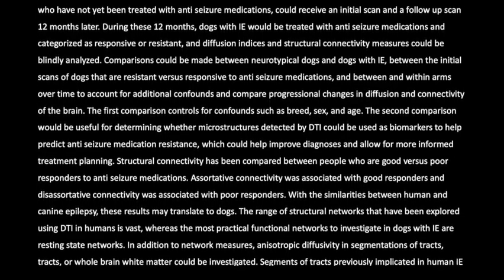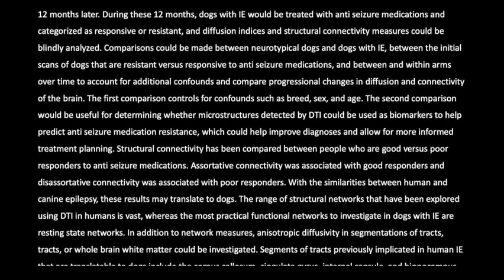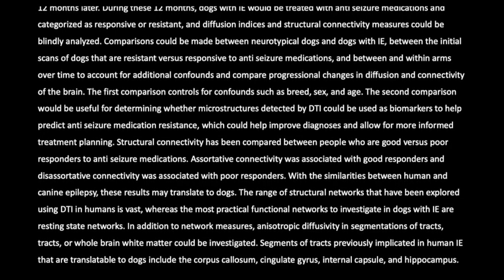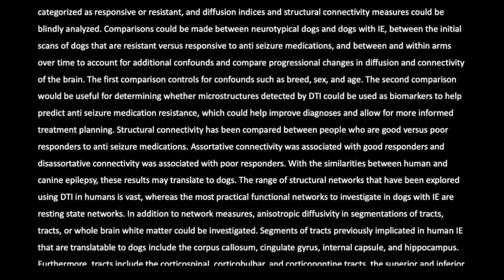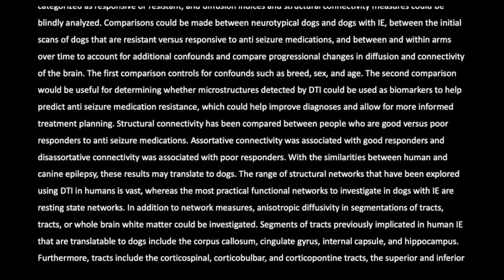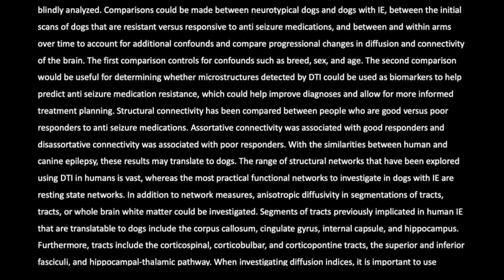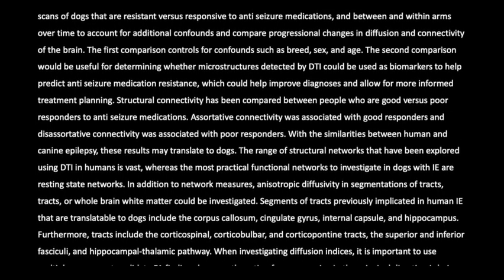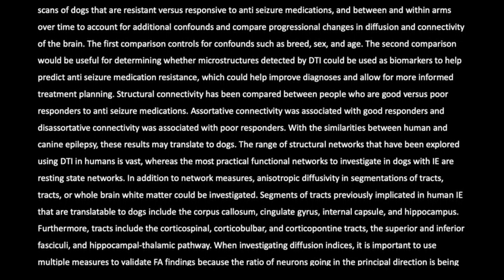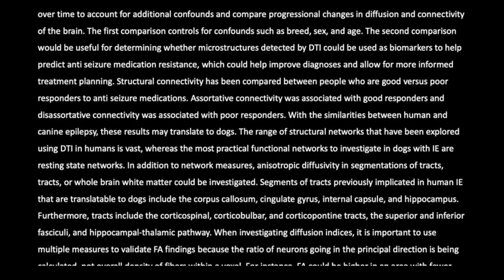The second comparison would be useful for determining whether microstructures detected by DTI could be used as biomarkers to help predict anti-seizure medication resistance, which could help improve diagnoses and allow for more informed treatment planning. Structural connectivity has been compared between people who are good versus poor responders to anti-seizure medications. Assortative connectivity was associated with good responders and disassortative connectivity was associated with poor responders. With the similarities between human and canine epilepsy, these results may translate to dogs.